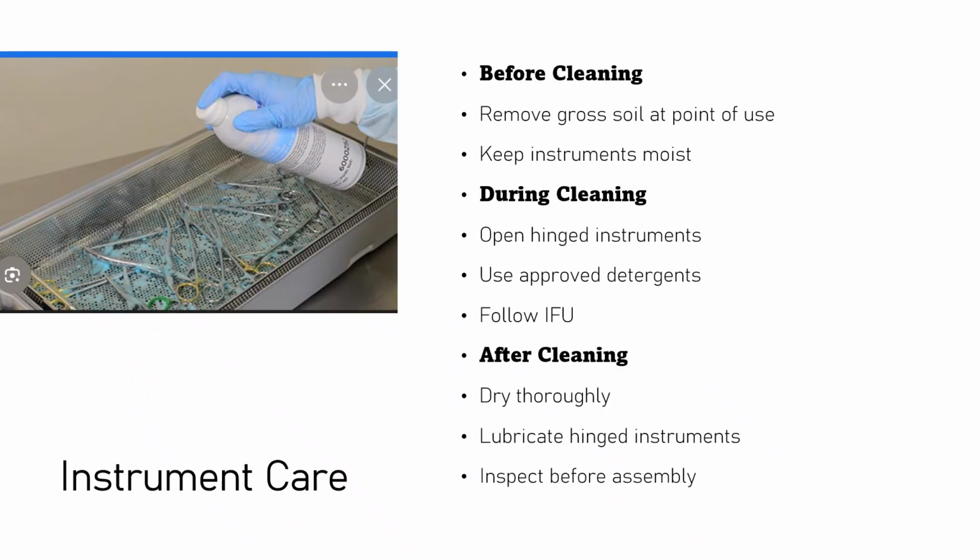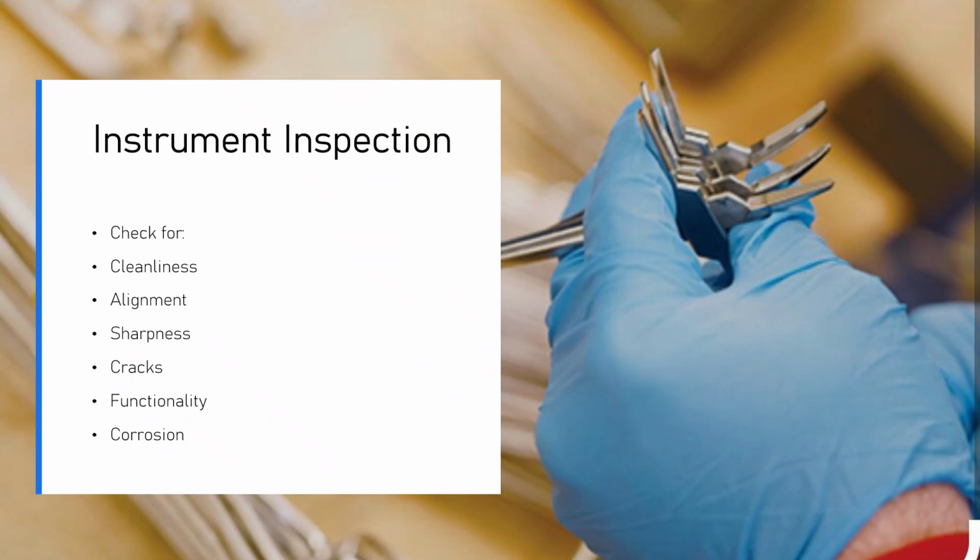Proper care begins at the point of use. Instruments should be kept moist, cleaned according to the manufacturer's instructions, dried thoroughly and lubricated when necessary. Every instrument must be inspected for cleanliness, alignment, sharpness, corrosion, cracks, and functionality. Damaged instruments should never be sterilized or used.